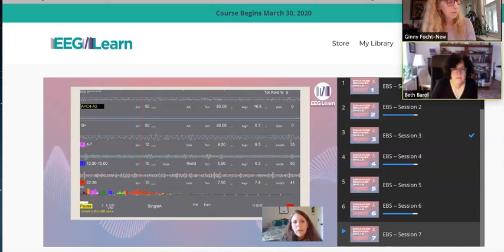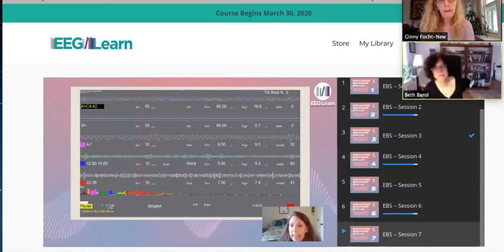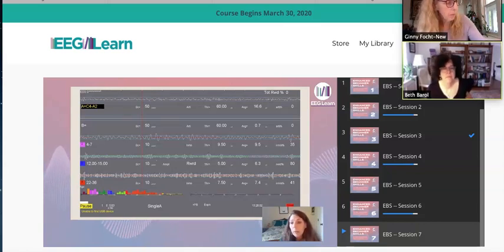And since 4 to 7 isn't really our primary concern here, I'm going to treat that threshold like a ceiling. I don't want that activity to go much above 10, so if I set that threshold at 9.5, that's like a ceiling. I don't want that activity to go above. And then that frees me up to tighten up the threshold on the fast frequency beta, which is going to be the primary focus of our training here.